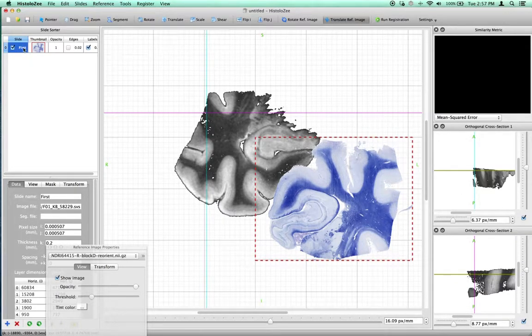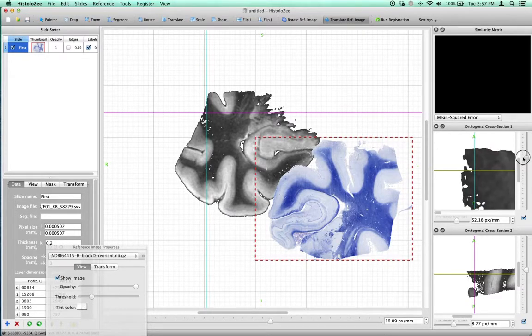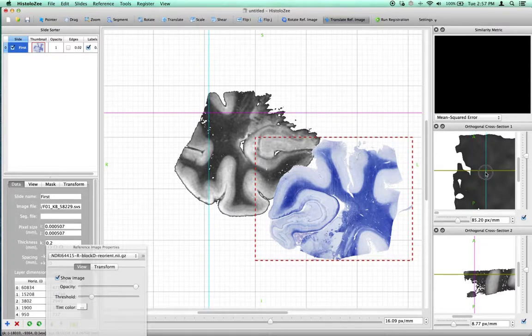By clicking the histology slide, what we've done is we've told the crosshairs to go to that location in our 3D world coordinates. So our crosshairs have just changed their K, or slice, coordinates to be at the location of that slide.